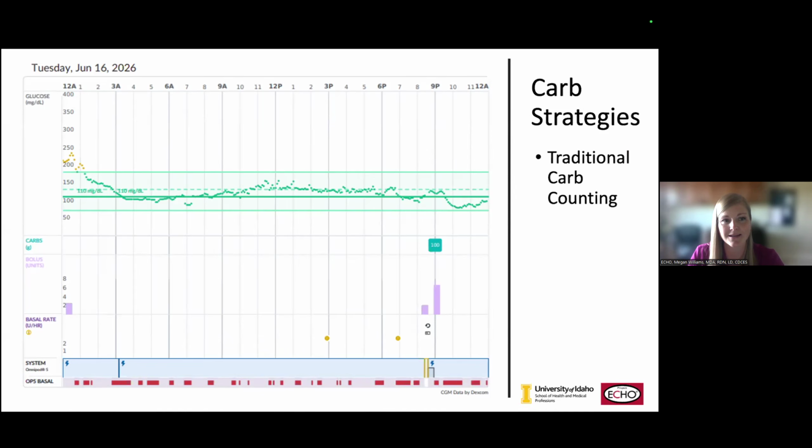If you're thinking about getting started with automated insulin delivery, find that patient because anything that you will do will improve their blood sugars, even if they're not carb counting. And for her, she couldn't remember to take her insulin. She lives in a trailer, low socioeconomic status, low education level. But with the support of her family, she could get this pod on every 3 days and her blood sugars within 6 weeks dropped to an estimated A1C of less than 7.